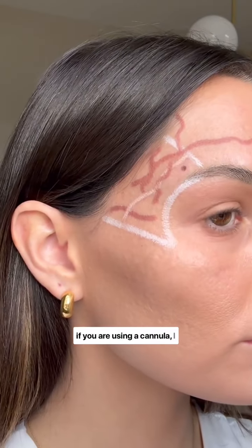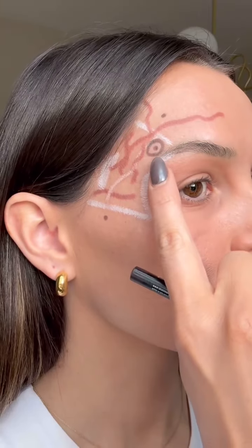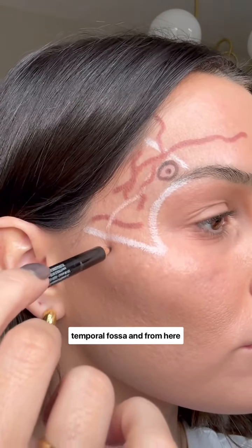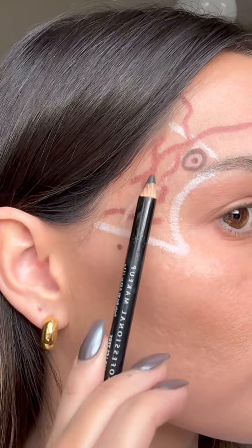If you are using a cannula, I like to use a 25 gauge 1.5 inch cannula, and here are the 2 port sites that I use. One of which is below the inferior border of the temporal fossa, and from here you can access layer 2 or layer 4, which are your intended injection layers when using a cannula.